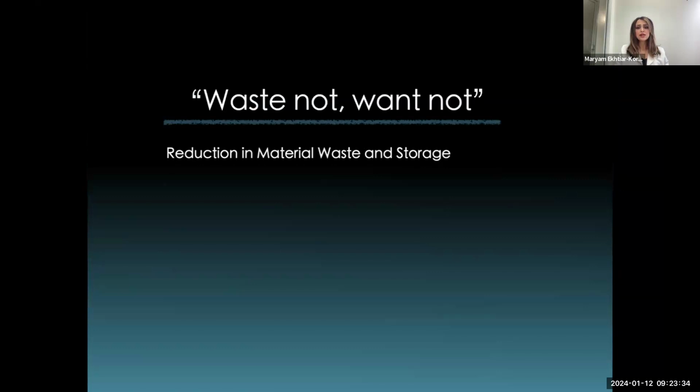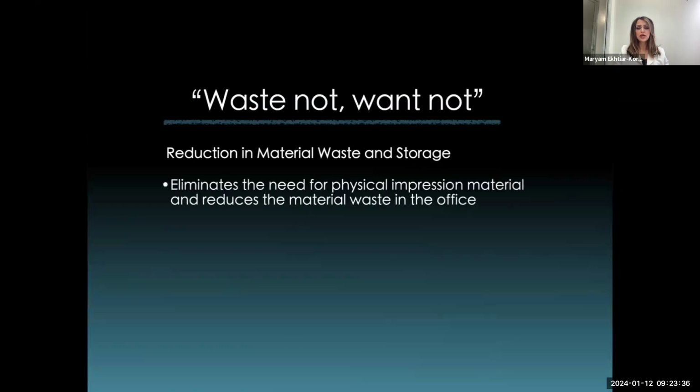So one thing that I absolutely love about having a digital scanner and my Fast Mill is that it has truly reduced the amount of storage space.